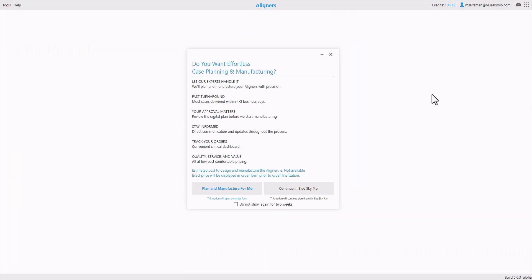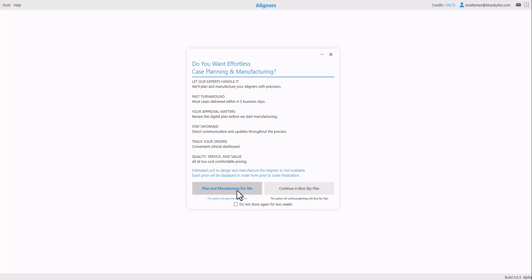And the software offers two options. Either the possibility to have the case planned and manufactured for you, in which case a prescription form will open on the screen, the relevant data will be attached, and the case will be outsourced for digital planning and manufacturing. We have the second option, which we're going to choose, which is continue in BlueSky Plan.